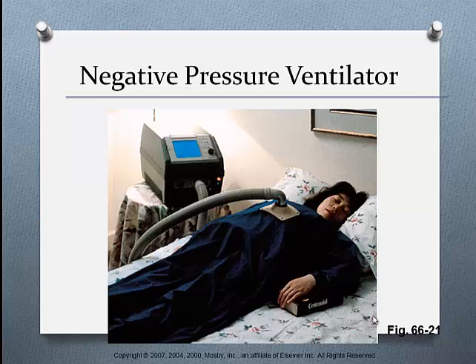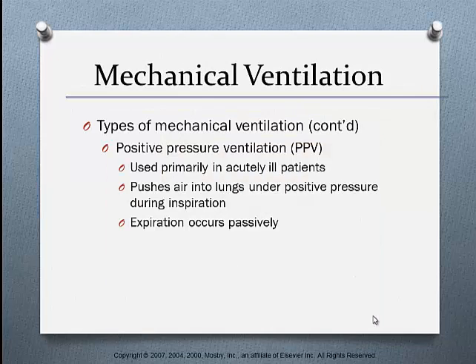It opens up the chest wall, draws in air, and causes a negative pressure. These machines were big and made exams and assessments on patients almost impossible. Here you can see you can really only assess her face and her hands. Types of mechanical ventilation.